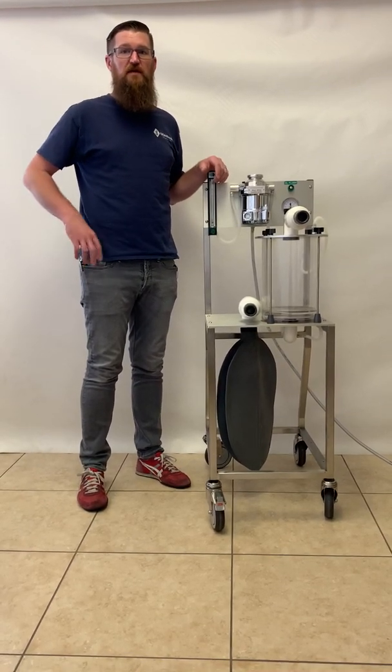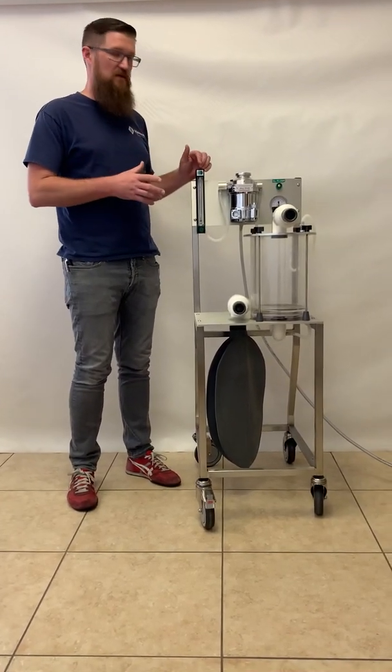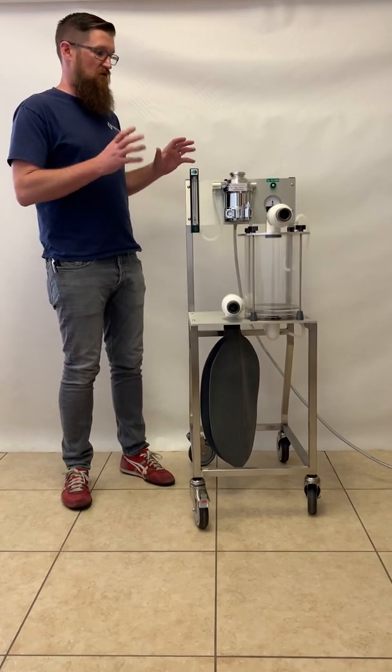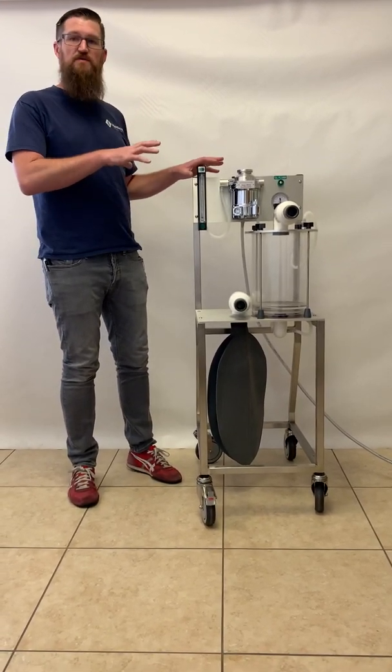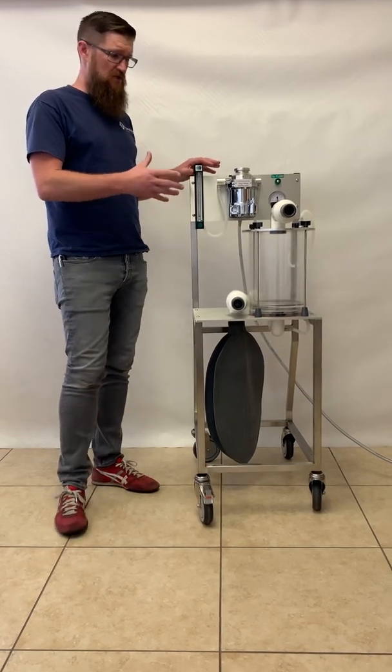Hi, I'm Joe from JD Medical, and I'm going to be going over the LAPD-1000 Large Animal Passive Anesthesia Machine components and function in operation.